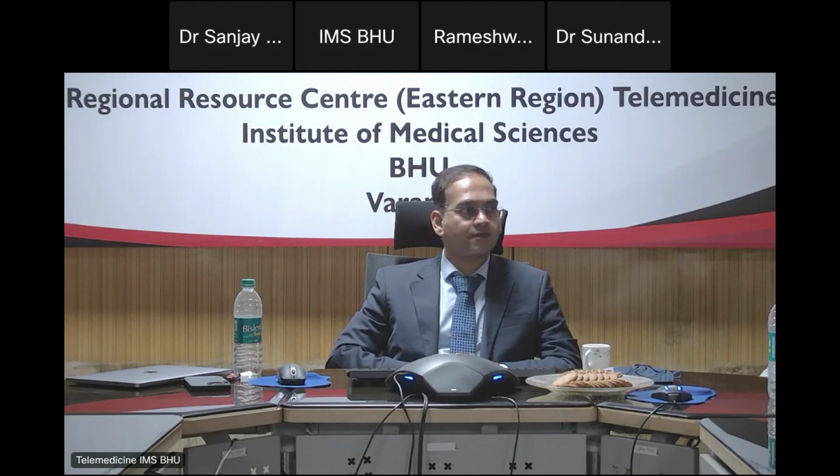I think I will just add to the point of multiple mycotic aneurysm. I came across around 4 to 5 years ago a case of multiple abdominal aortic aneurysms, and they were associated with bulky lymph nodes throughout the abdomen.